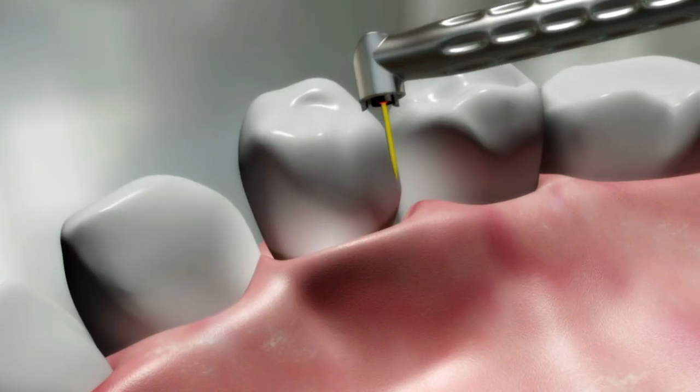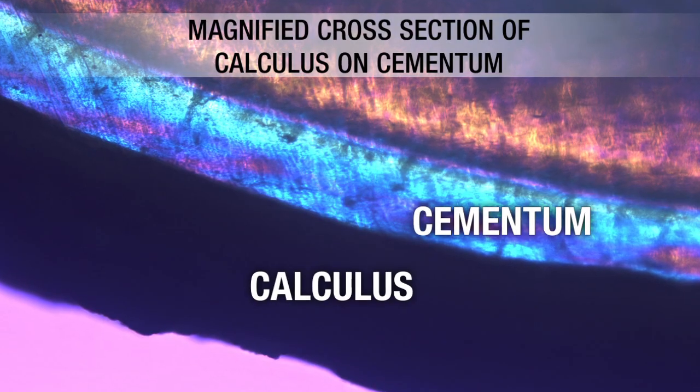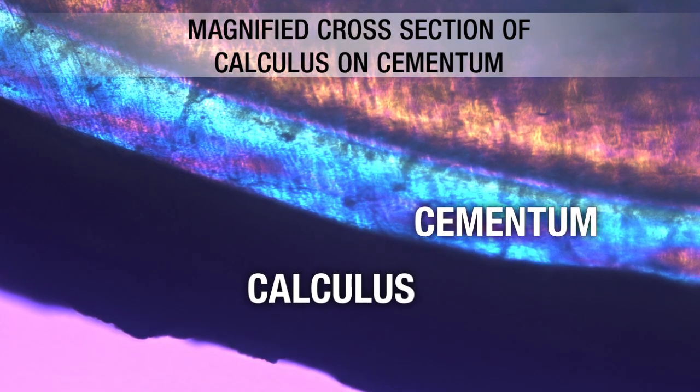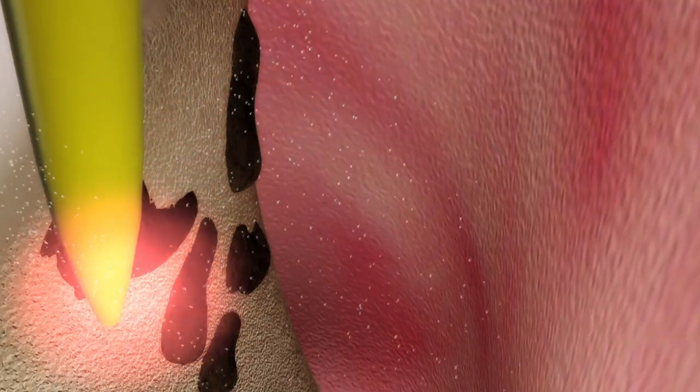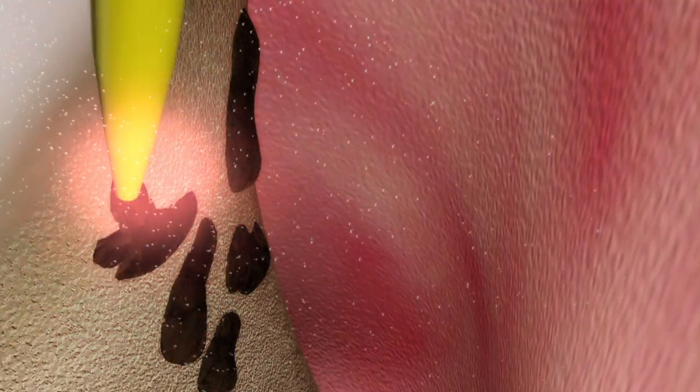Next, we insert a specialized Erbium YAG handpiece tip with water spray into the pocket to remove calculus at subablative laser energy. The special tip utilizes photon-induced photoacoustic streaming, or PIPS, to remove the calculus and disrupt the destructive biofilm on the root surface.